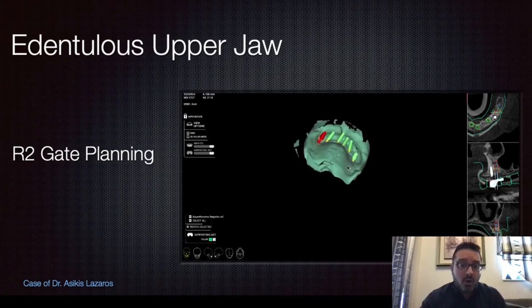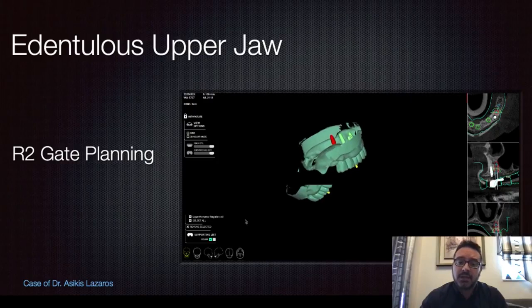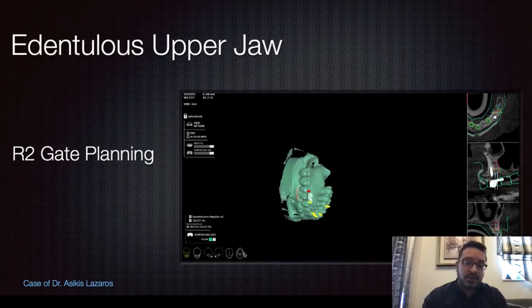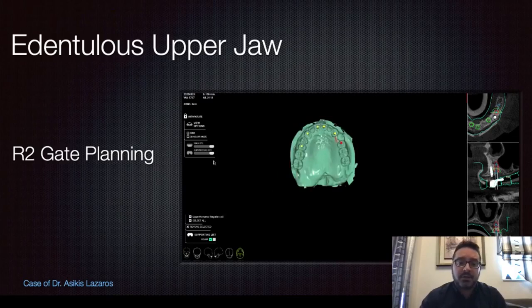Lowering the cost of the prosthetics is one point of using the surgical guides. Even if you can place an implant, the cost goes up because you have to use multi-unit abutments or a complex system, which is something that we don't need.